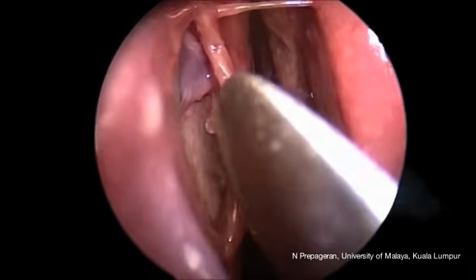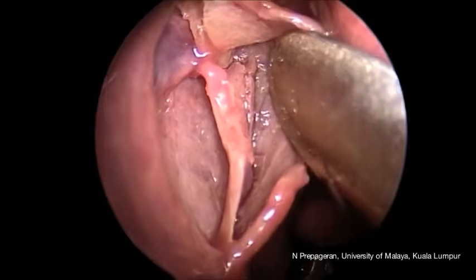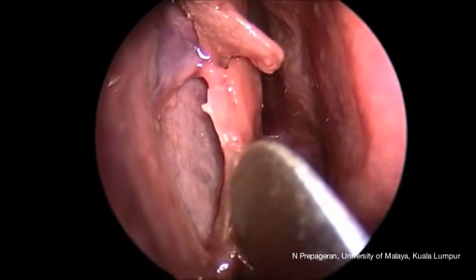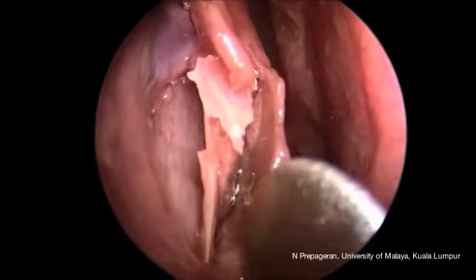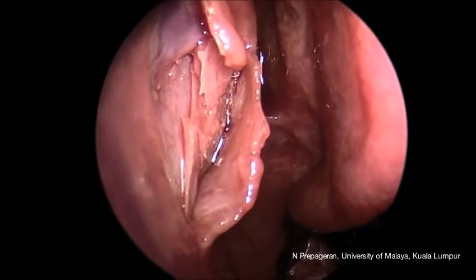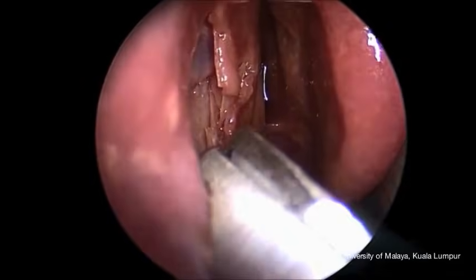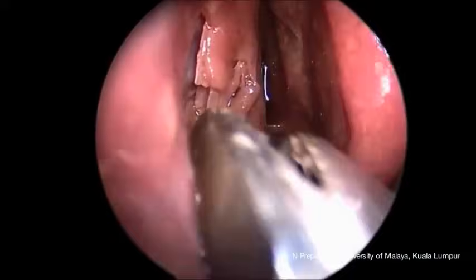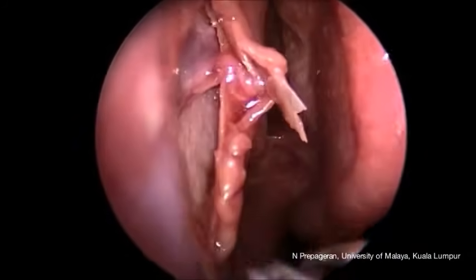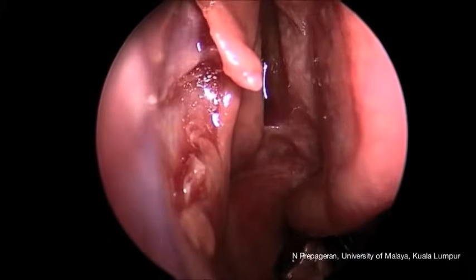I'm going to dissect to show you the anatomy of the mucosa and bone. I have elevated the uncinate process to show you the blind sac of the uncinate process itself. It's like a sandwich with mucosa medial and lateral to it and the bone right in the center in the form of a boomerang. This is how the uncinate process forms over the ostiomeatal complex and the OMC recess.